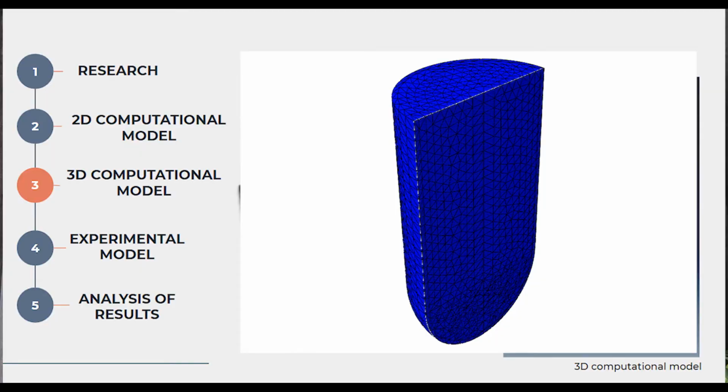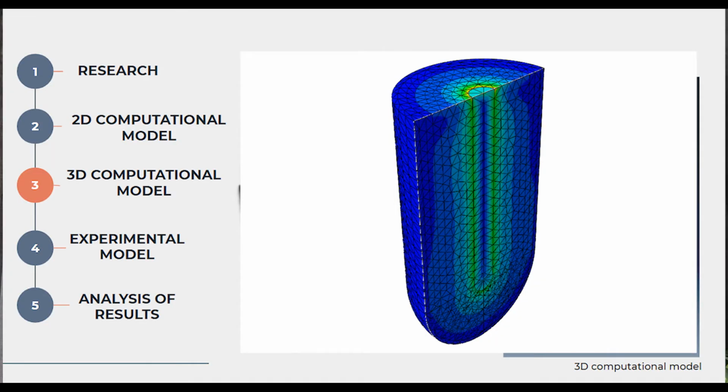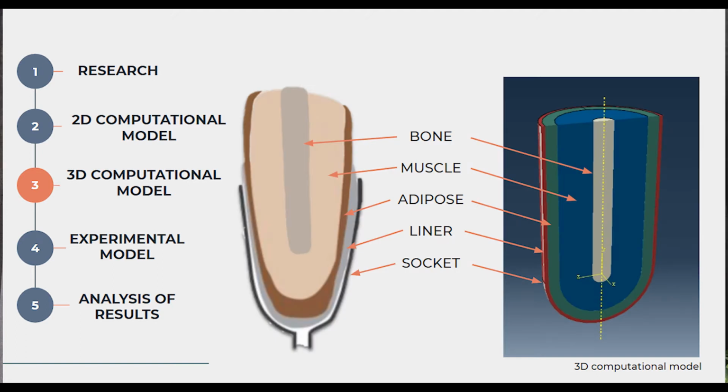Through iteration and validation by comparison to the literature, we were then able to investigate the effects of more complex multi-axial loading situations, which is a much more realistic representation of a transtibial prosthetic assembly. By creating a three-dimensional model, these effects could be investigated. Implementing the knowledge we had gained with the previous model, we were able to analyse the effects of varying specific components of the system. We approached this by identifying all the plausible variants in the system.